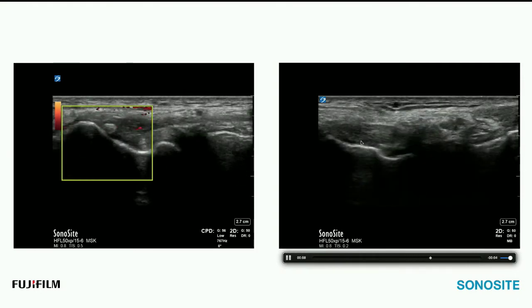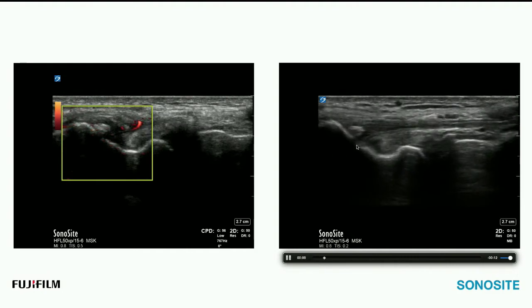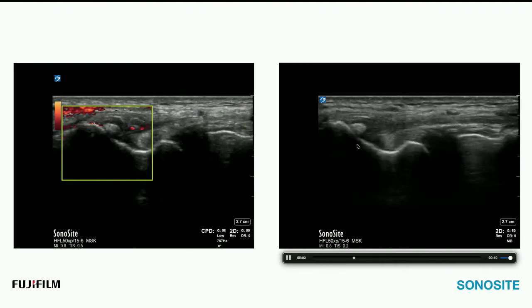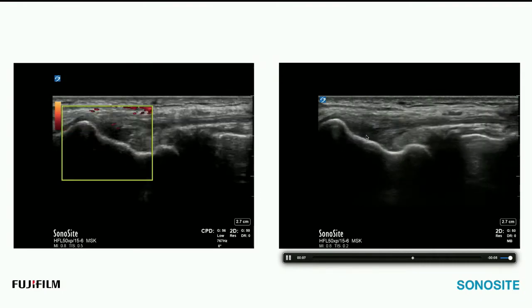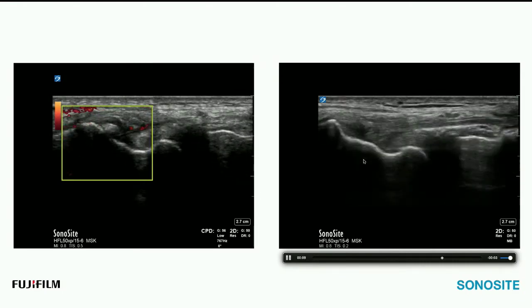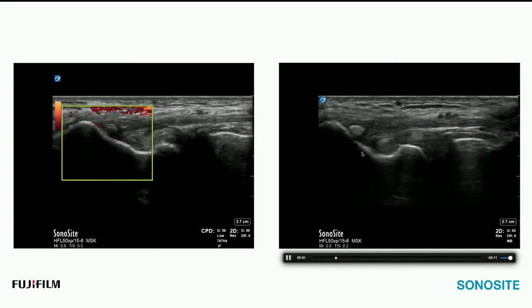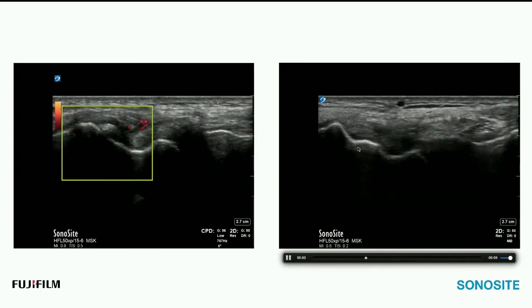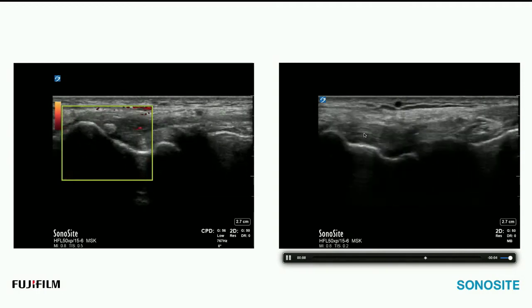But some of these other parts right here that are not shadowing, say this was a patient that presented only with that bright hyperechoic structure in the tendon that did not shadow, you want to watch out for those because they're not quite going to show up on a radiograph if they're not shadowing. So they're not dense enough to cast a shadow on ultrasound. You're catching calcium at an early enough phase that it could possibly be lavaged and aspirated.